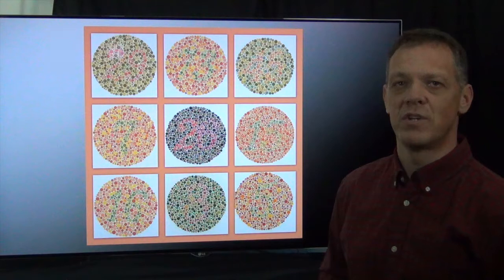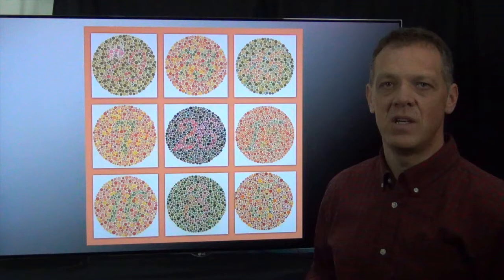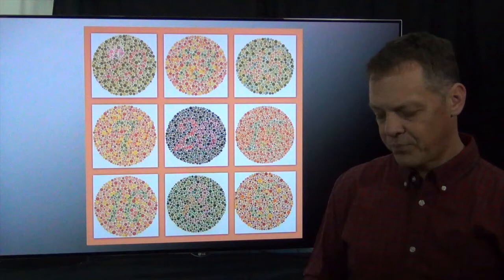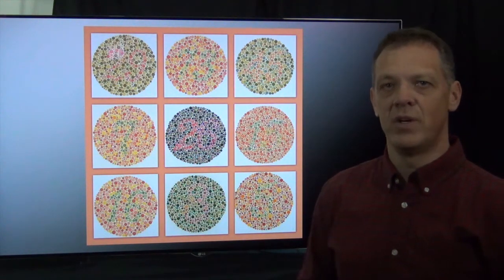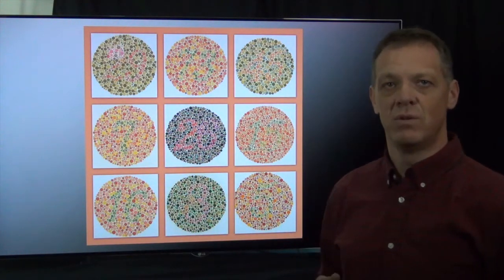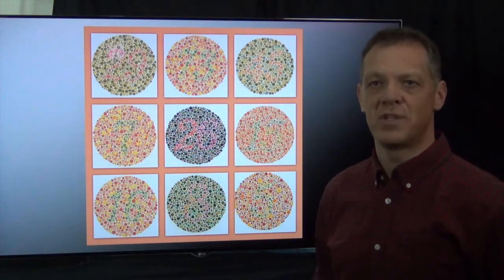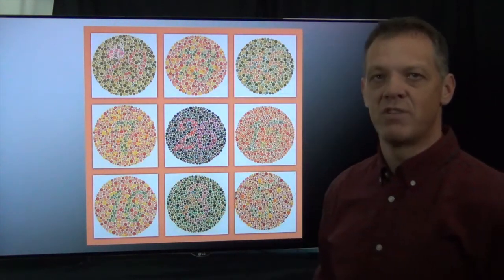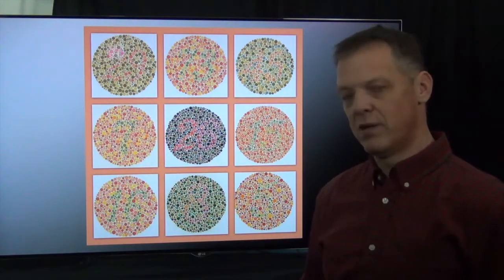One of the first questions we came up with is, what does his world look like? What does he see when we watch video or movies? As part of the color processing that I figured out, there's a lot of research that's been done on it, and I've used that as the basis to simulate color vision deficiency, and ultimately on the Prisma we're able to compensate for it and adjust the colors. To answer the first question, on the Prisma I have a set of tables that I can select that will simulate the color vision deficiency.